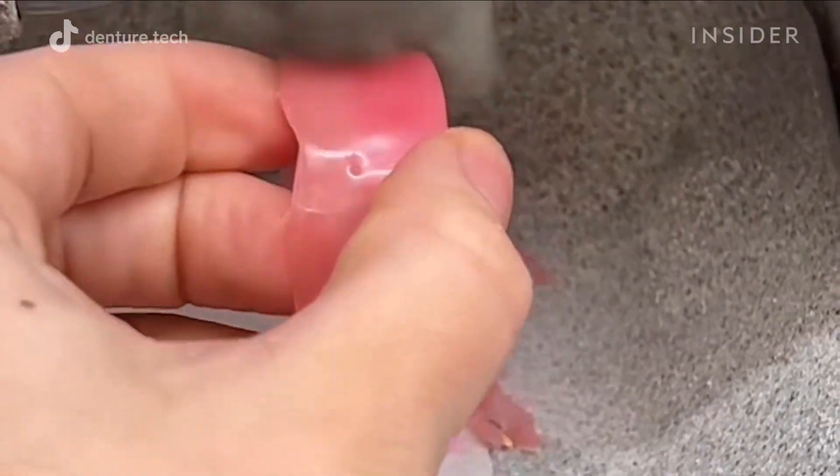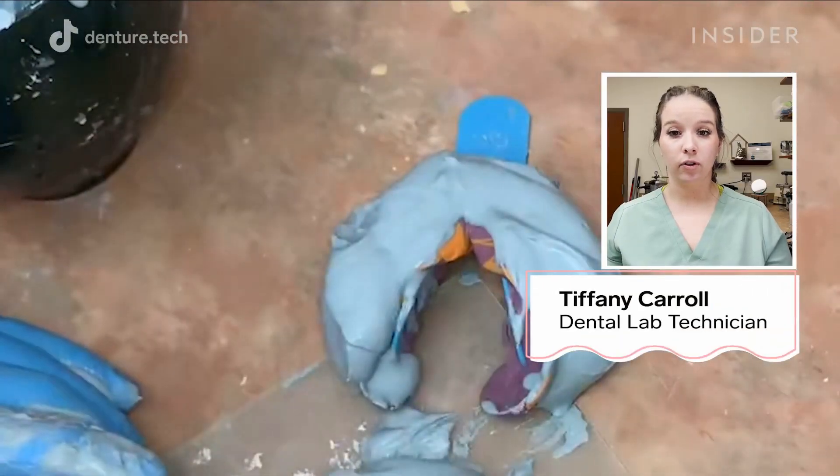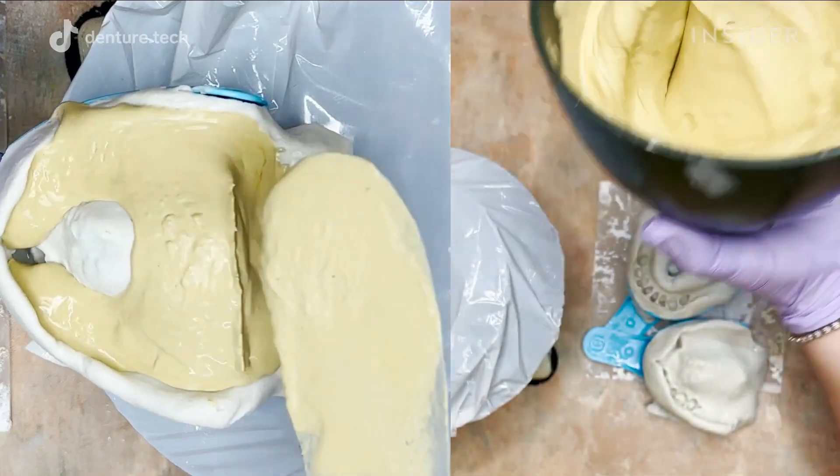Tiffany Carroll of Denture Tech has been making false teeth for about six years. First, we're going to start with an impression. To make anything, you have to have a good foundation. So once we take an impression, we'll take stone and we'll work with stone and cut them out.